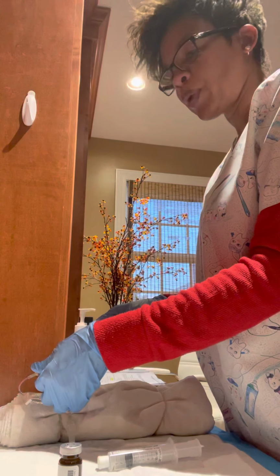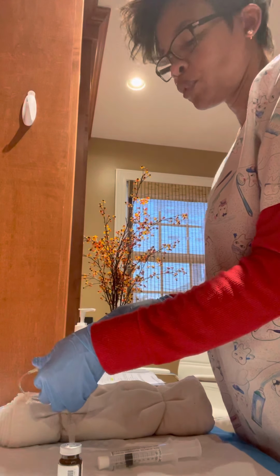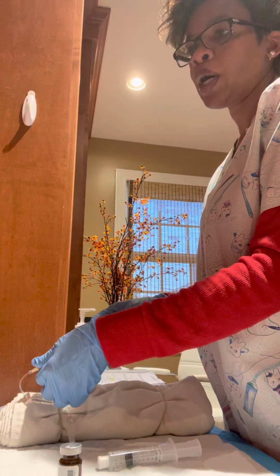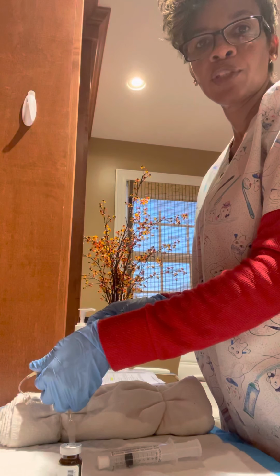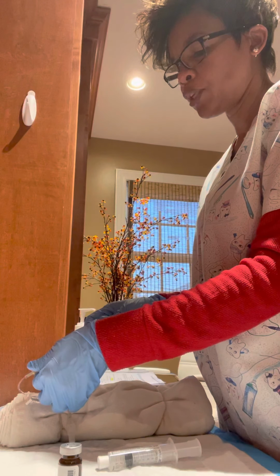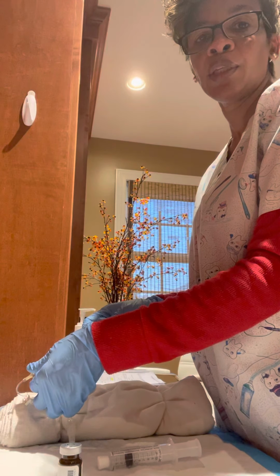So that way it's not like an awkward silence, just infusing the med, but just, you know, slowly while talking to her, while I'm also checking the time as well. Some medication should be infused slowly.